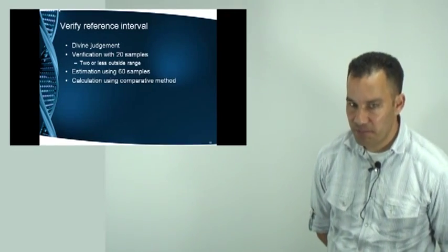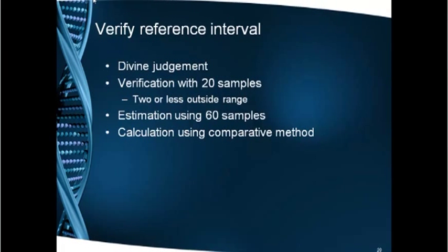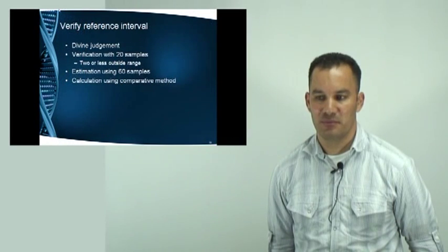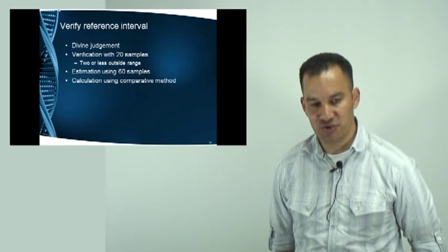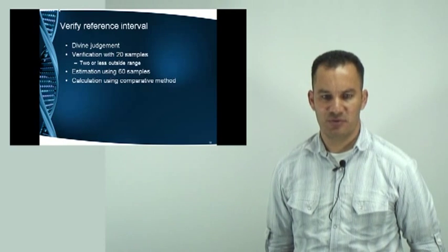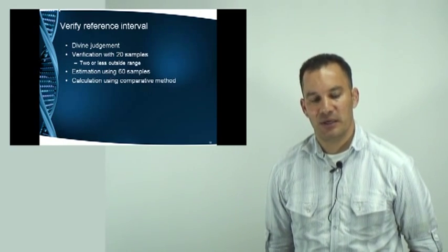One of the last parts of my presentation will be on verifying reference intervals. It's a very simple thing to do, but usually laboratories don't do it nowadays. I try to put a lot of attention to it, because I think it's something that you need to verify, because otherwise you will be surprised.